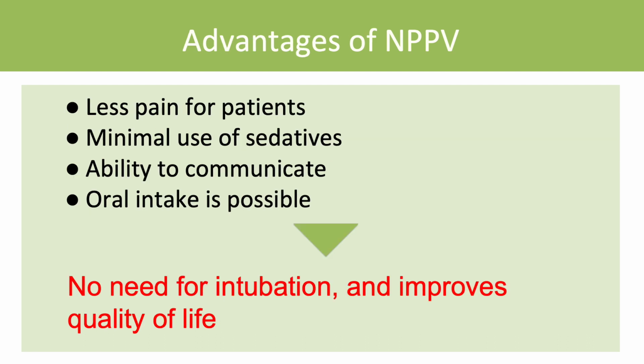The advantages of NPPV are less pain for the patient, minimal use of sedatives, ability to communicate and intake orally. These are all considered to be advantages of not intubating, leading to improved quality of life. It is important to note that unreasonable use of NPPV to keep avoiding intubation may lead to worsening the patient's condition. If necessary, transition to intubation management should be done at the right time.